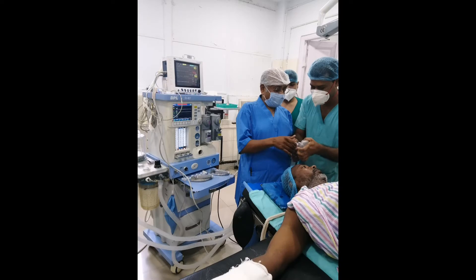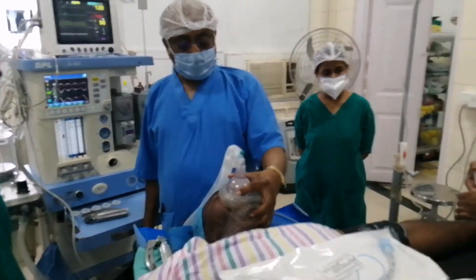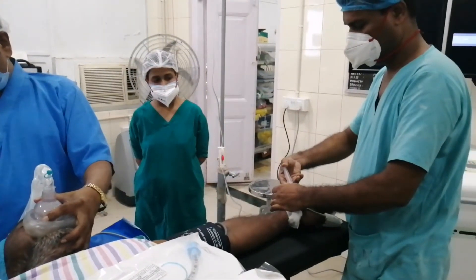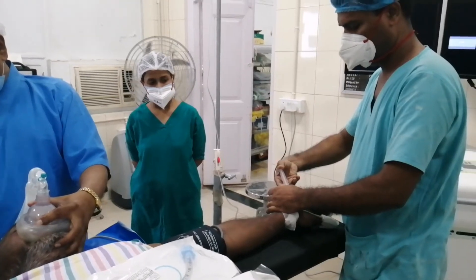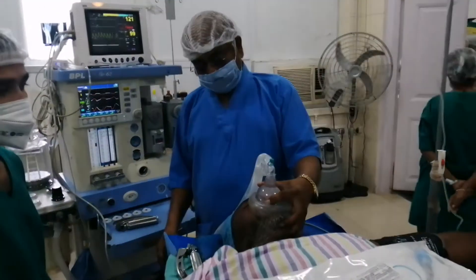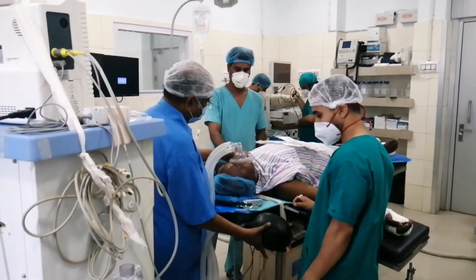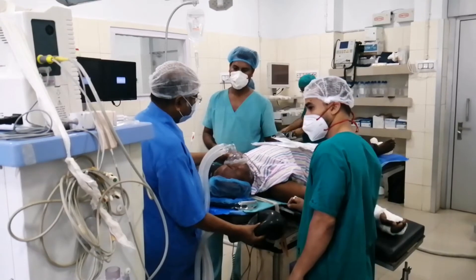Before anesthesia, Dr. Naha is checking the patient's pulse, BP, and oxygen levels. Dr. Naha is giving the oxygen while his assistant is pushing the drug. Now the doctor is checking whether the patient is asleep or not.